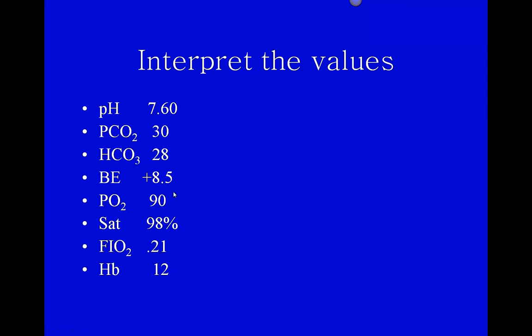The person's not hypoxemic. They have adequate hemoglobin. I would expect that because their bicarb is higher than it should be, that I have a base excess, a plus number here. Let's see if we got it right. Combined alkalosis. I'm not going to put too many combined defects on the quiz because then you don't have to look for compensation, and that would remove some of those steps of the process.